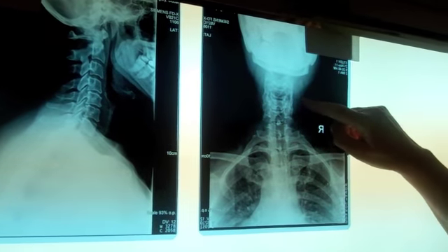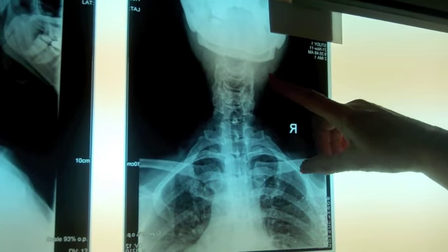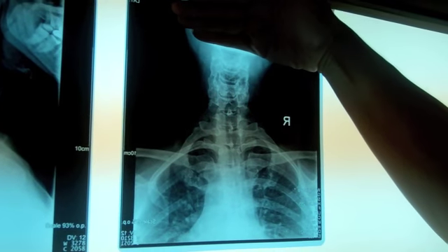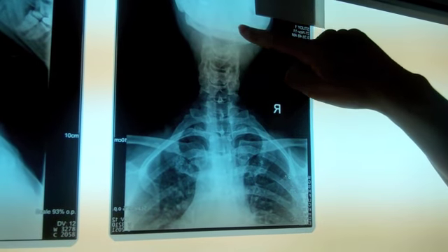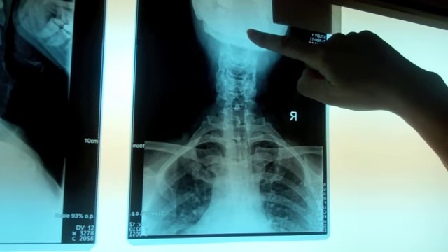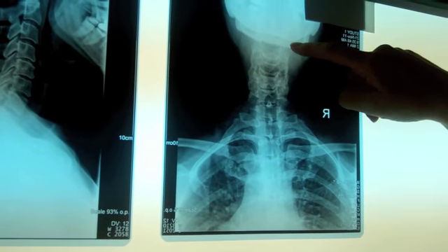On this one we can see the spine from front to back, and the last one was a lateral view from the side, but this is a front to back view. Here we can clearly see that the skull is not straight, which would tell us that the first vertebra was also rather out of line. I can just about see a little bone called the dens in here, and I can see a bigger space on the right than the left, and together with this we would definitely check the first vertebra to see if it was out of line.